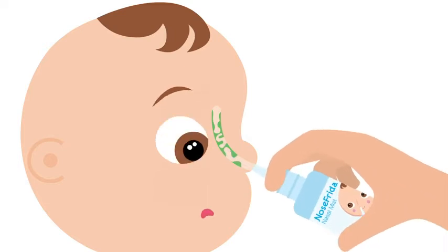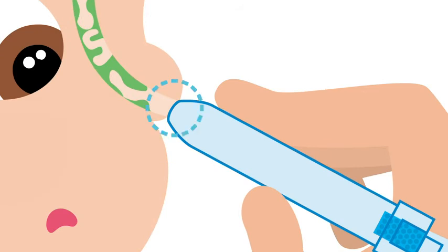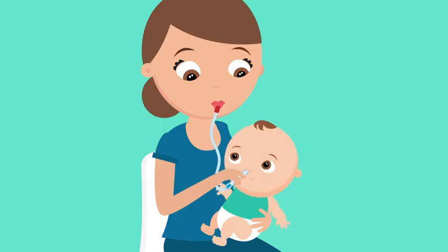First, soften those stubborn boogies with a natural saline mist. Then, simply place the tube to form a seal with the outside of baby's nose and suck away the snot.